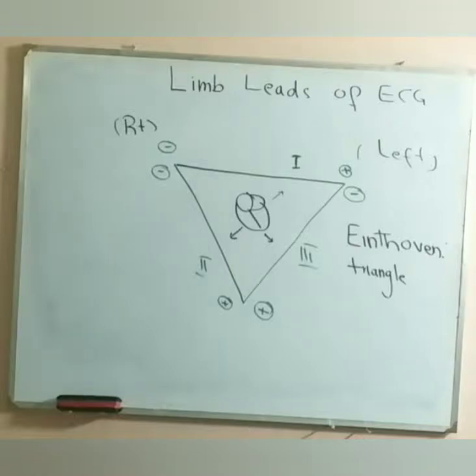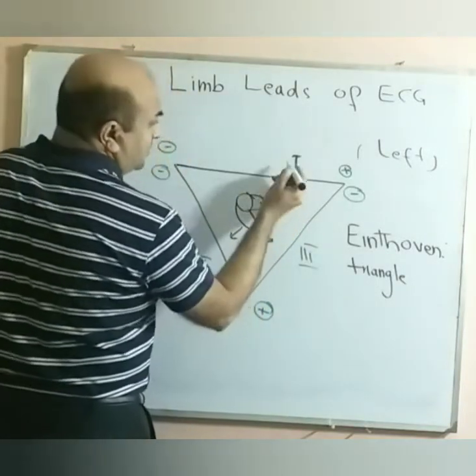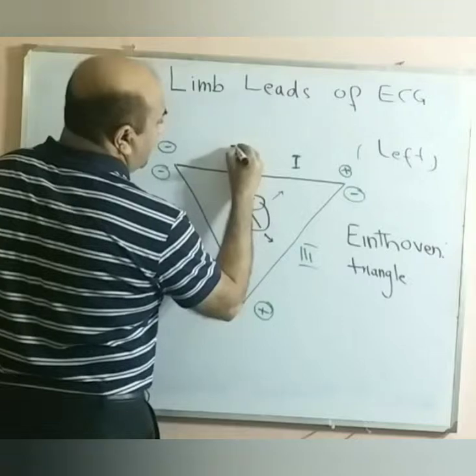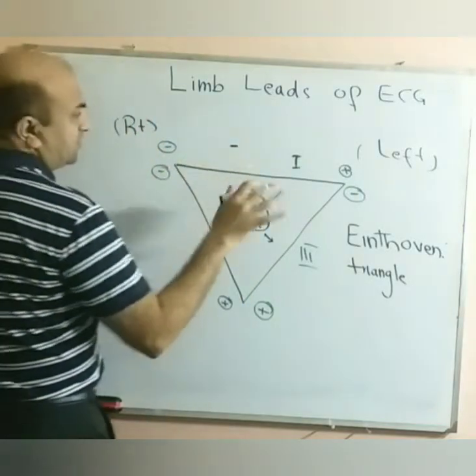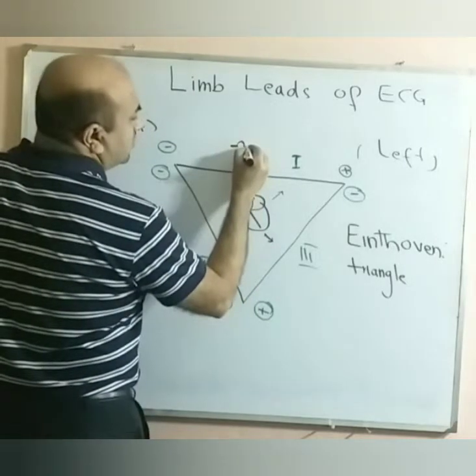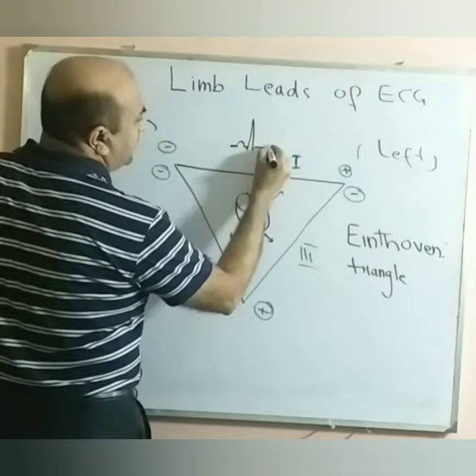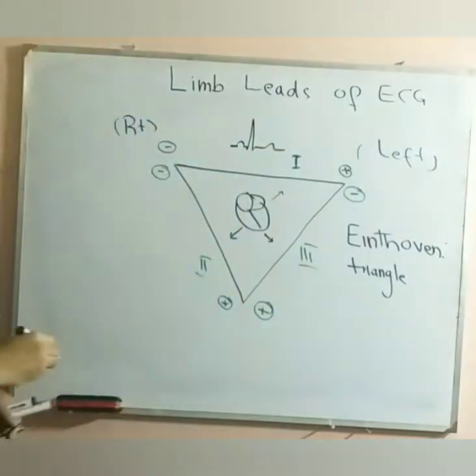So the initial ECG paper, which comprised of only 3 leads, which were the bipolar limb leads 1, 2 and 3, they were positive. Let me draw. Wave of depolarization was moving towards lead 1. So they made a positive lead on the ECG. P for atrial depolarization, QRS complex for ventricular depolarization, and T wave for ventricular repolarization. So lead 1 was a positive lead.